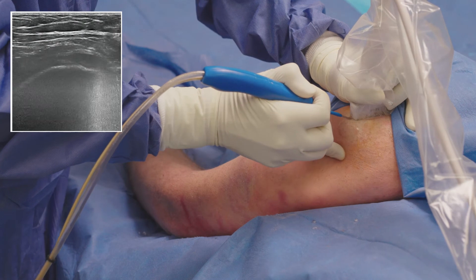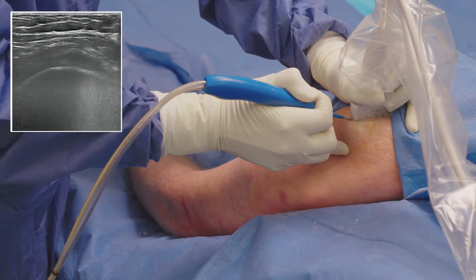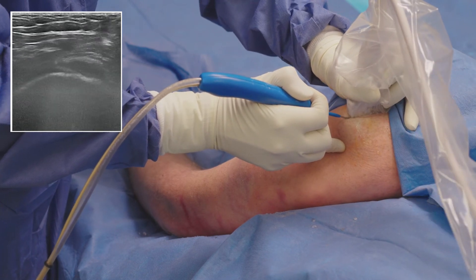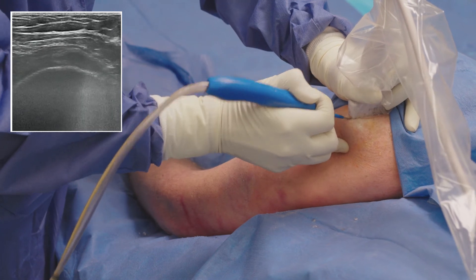While debriding the diseased tissue, I rotate the device to expose the pathology to the cutting window. I also use a gentle pistoning motion forward and backwards to reach all of the pathology that is causing pain for the patient.